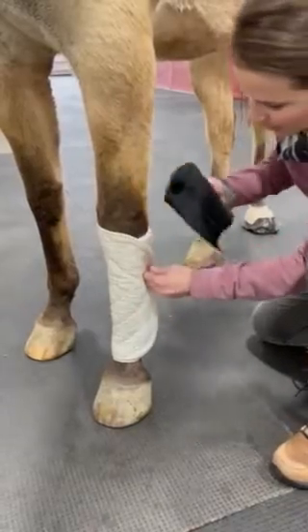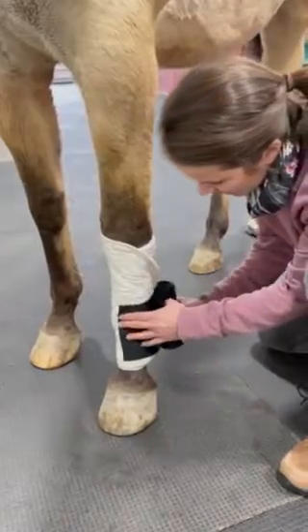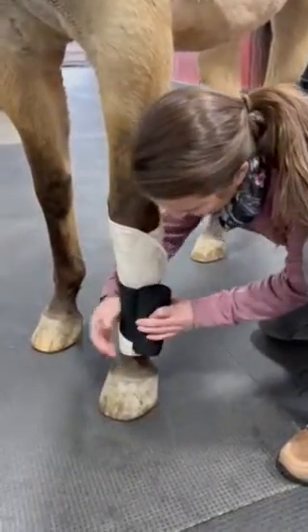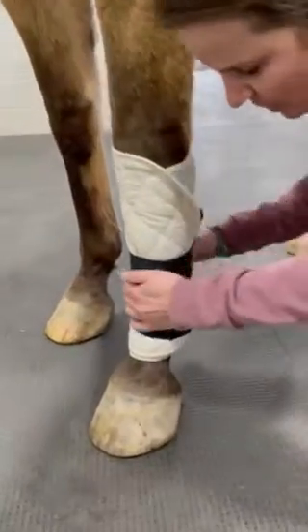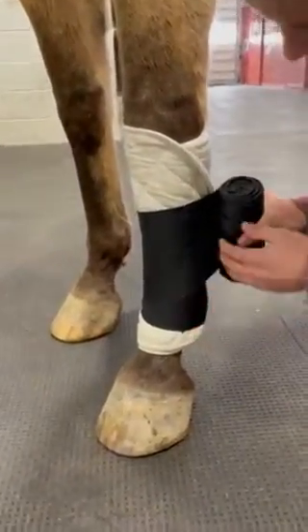We're going to take our standing wrap and in this case I'm going to start at the bottom. I'm going to lay it there and when I come around I'm going to pull around the back, place around the front, and then pull as I come around the front again. I'm going to overlap by 50% each time I go up, so about 50% of the wrap is covered.